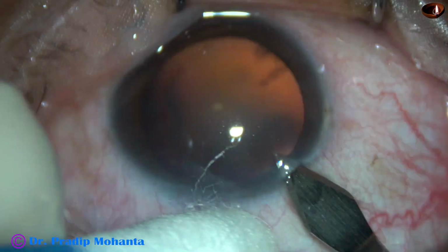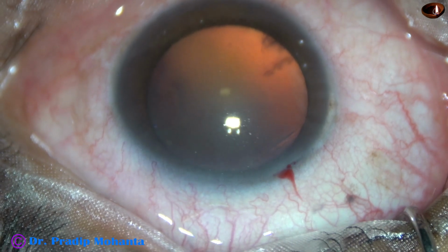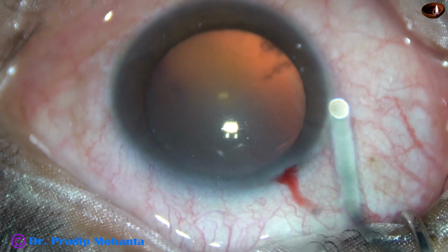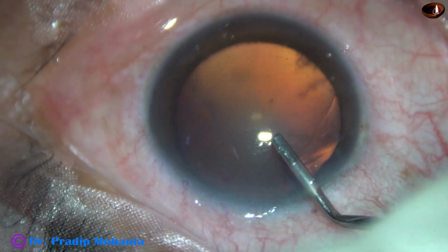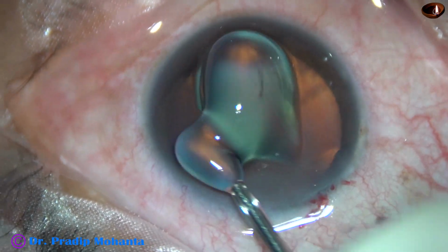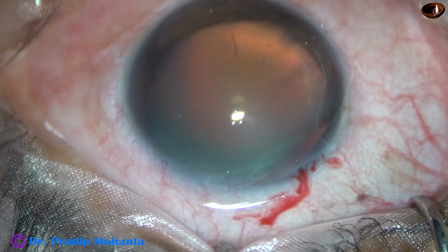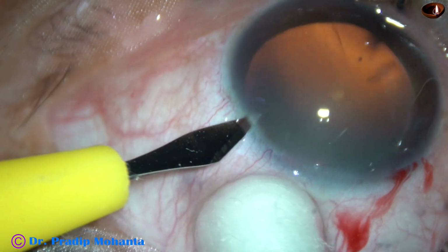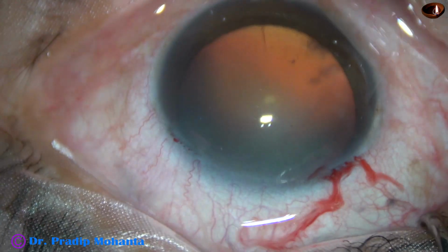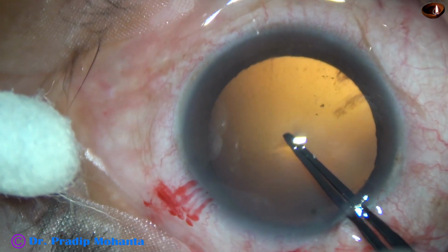This is the main incision with a 2.8 mm steel keratome on the posterior aspect of the limbus. And now the anterior chamber is filled up with 2% hydroxypropyl methylcellulose, and the methylcellulose is applied over the corneal epithelium for better visibility. This is a side port on the left side of the main incision, and this is the capsulorhexis.